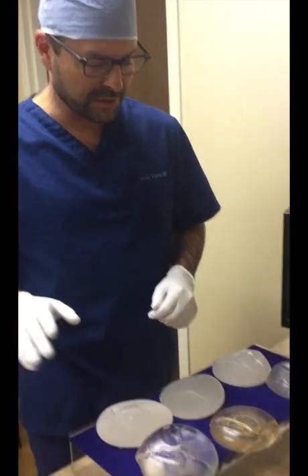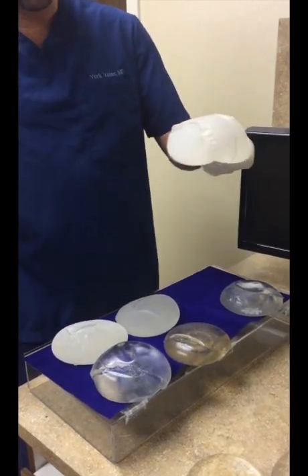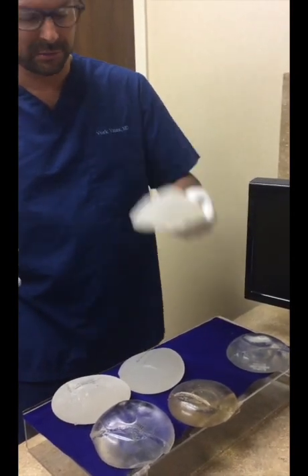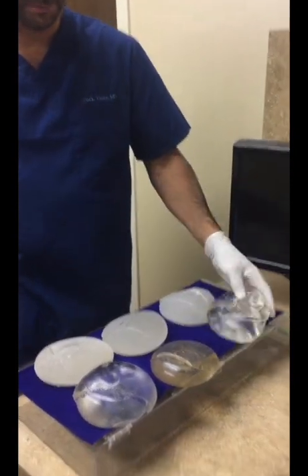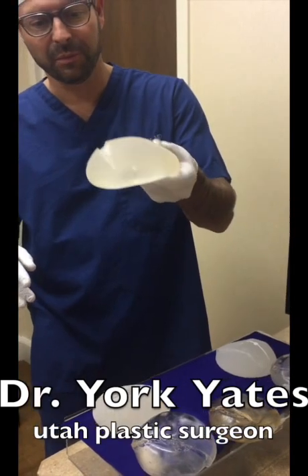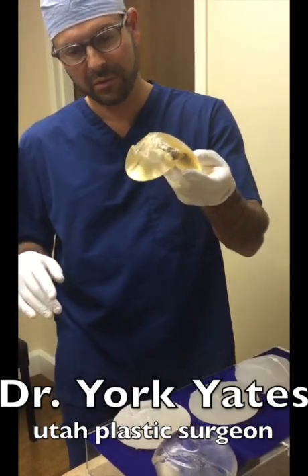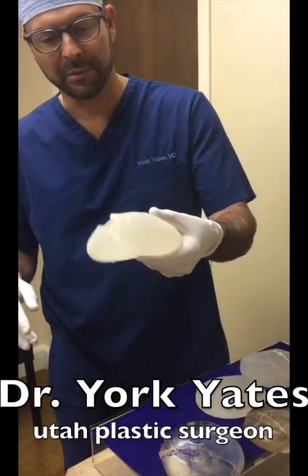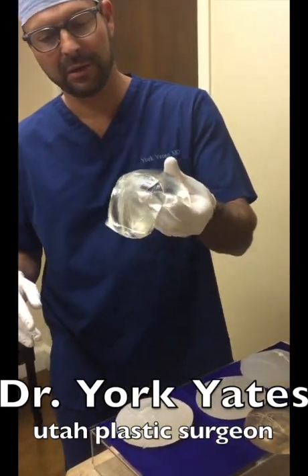The middle two I've warmed up in the microwave just to see if body temperature changes things — and it didn't actually change it all that much. The Sientra teardrop is pretty stable and holds its shape pretty well even with gravity. The Sientra round is less so — it doesn't really hold its shape after it's been split. The Mentor warmed teardrop holds its shape really well. The Mentor round, not so well — quite a bit worse than even the Sientra. The Allergan or Natrelle teardrop holds pretty well, and the Inspira round, not so well.